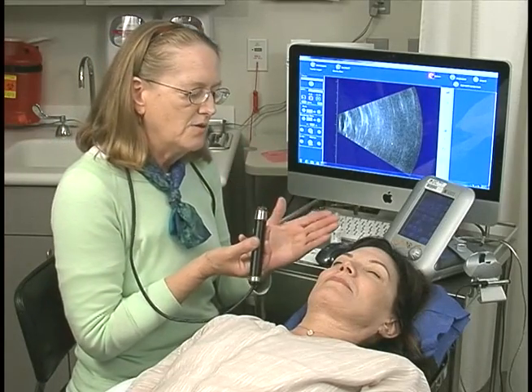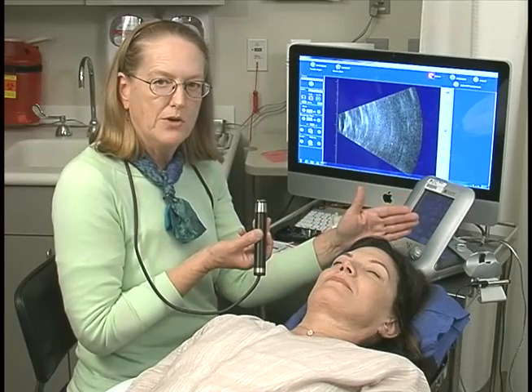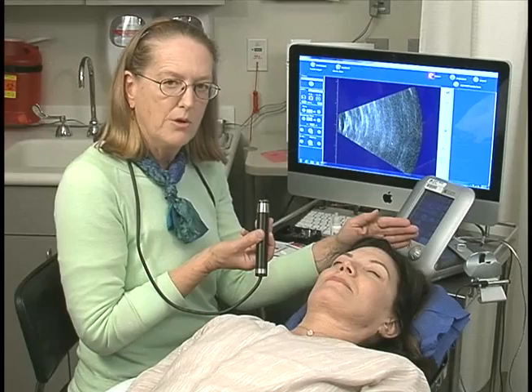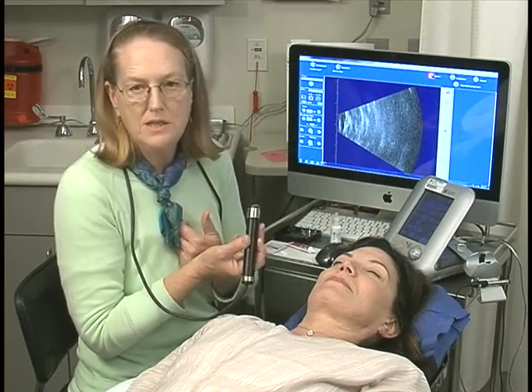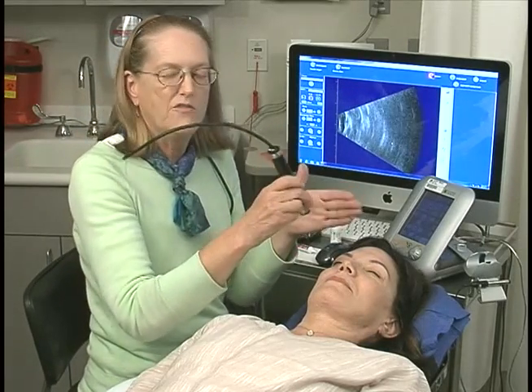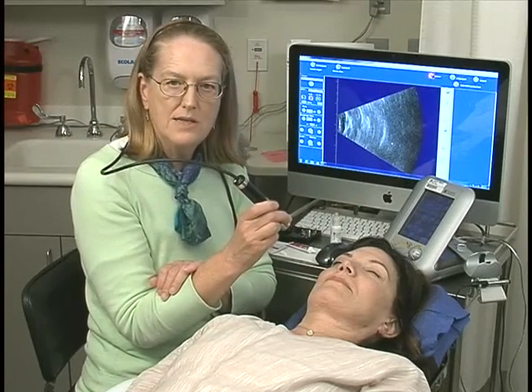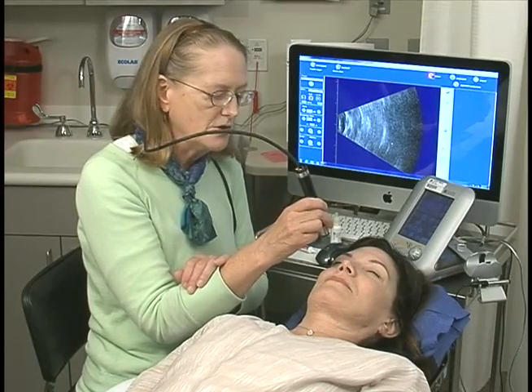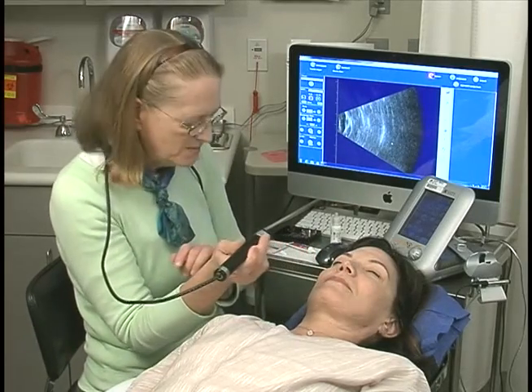We'll start our four-quadrant exam with the patient looking superiorly. The farther away the patient looks from where I place my probe, the more anterior periphery I can get with the sound. I start every single one of my transverse scans, either horizontal or vertical, by first localizing the optic nerve. Once we've imaged the posterior portion and the optic nerve, I will then sweep the probe so that the superior aspect will be seen.